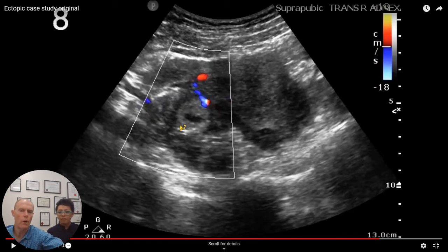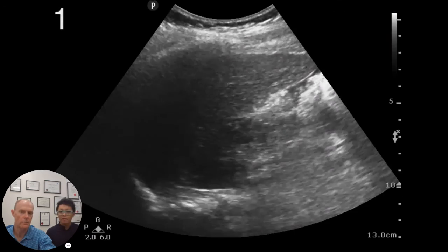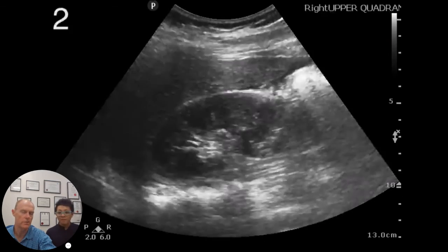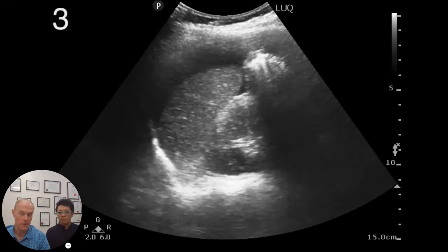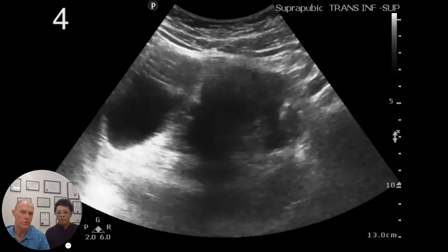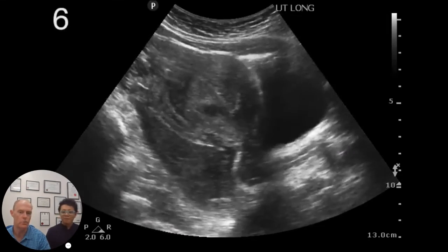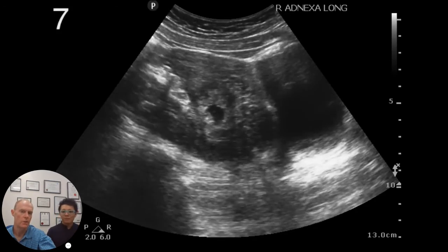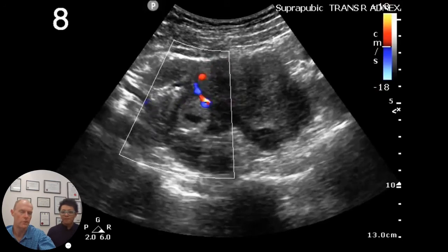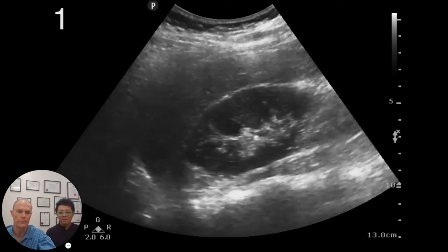So the lead-in as to why we would think this is an important skill to have is that you can actually help diagnose, risk stratify, speed up the speed of diagnosis, and even improve safety and outcomes. This type of skill is taught on our postgraduate certificate courses. It's taught in an approach to unstable patients in a part of the course called peri-arrest, and it's also taught in our pregnancy section in the first trimester, where we're looking at problems of first trimester pregnancies of women that come to acute care and emergency departments.